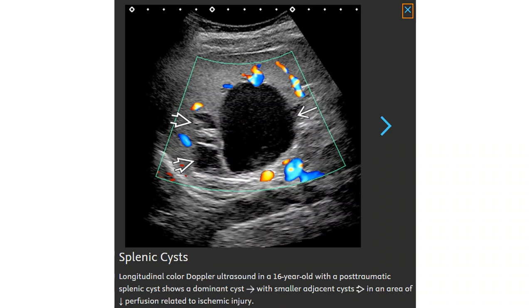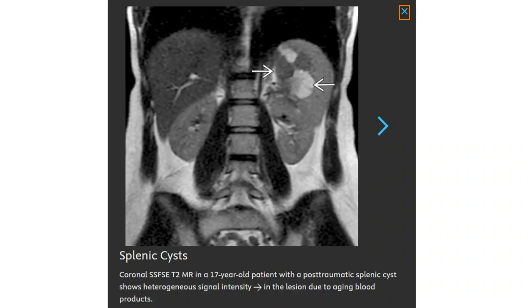Color Doppler ultrasound in a 16-year-old girl with post-traumatic splenic cyst shows a dominant cyst with smaller adjacent cysts in an area of decreased perfusion related to ischemic injury. SSFSE T2 imaging in a 17-year-old patient with a post-traumatic splenic cyst shows heterogeneous signal intensity in the lesion due to aging blood products.